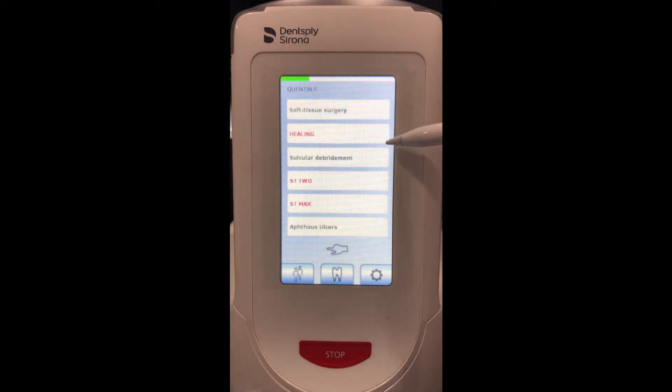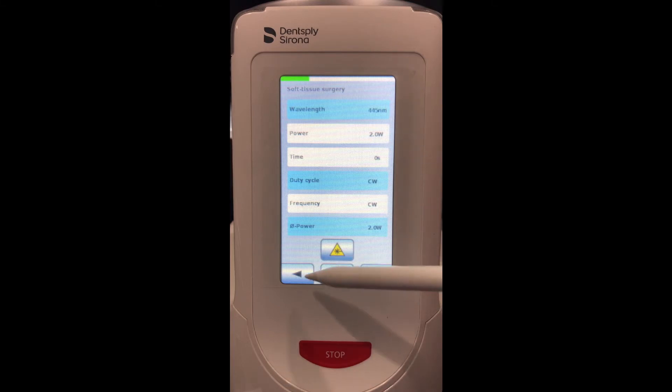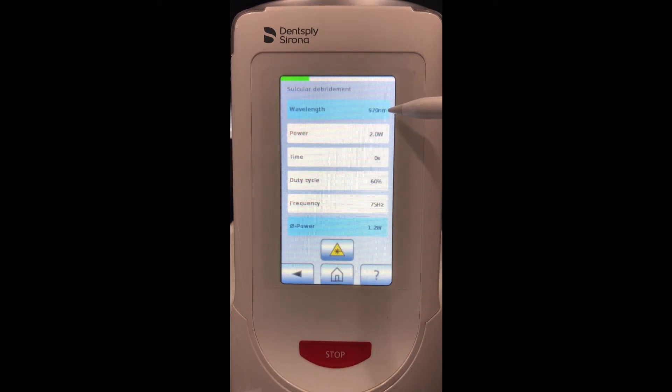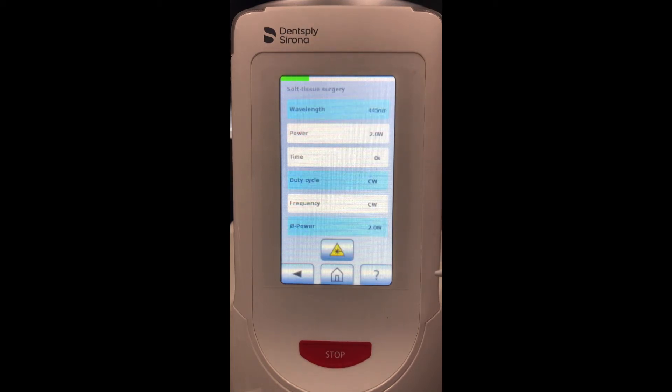Back on the home screen, anything in black was pre-programmed and anything in red are ones that I actually created. Notice healing is the 660, surgery is 445, and sulcular debridement uses the 970. All can be programmed or selected when we want to pick a procedure for a patient.